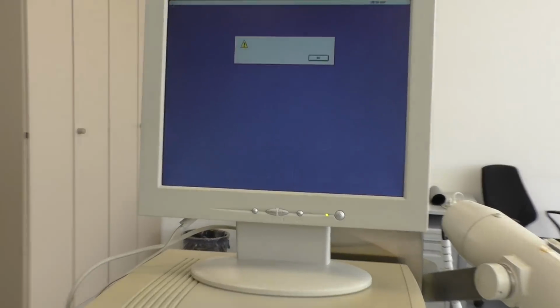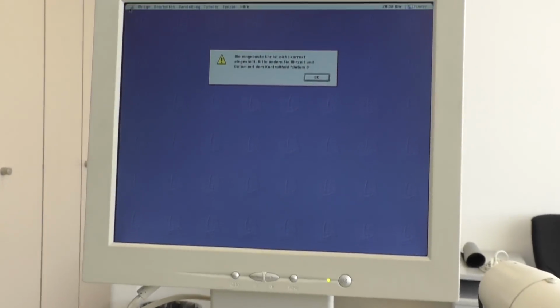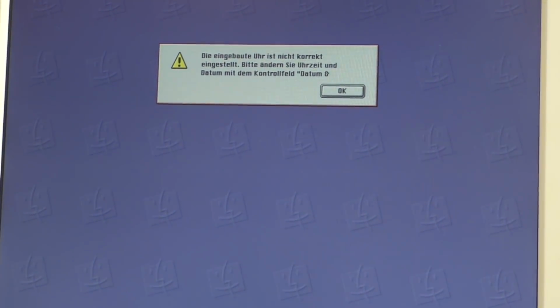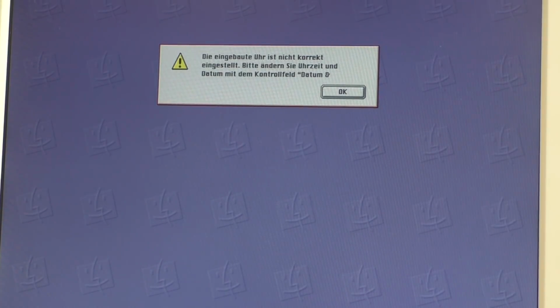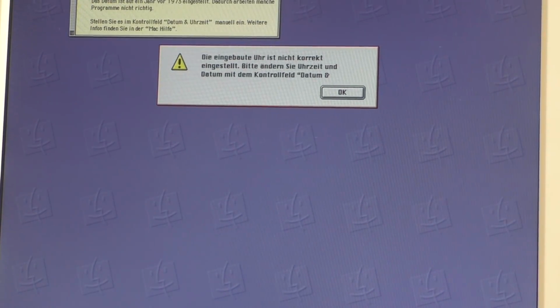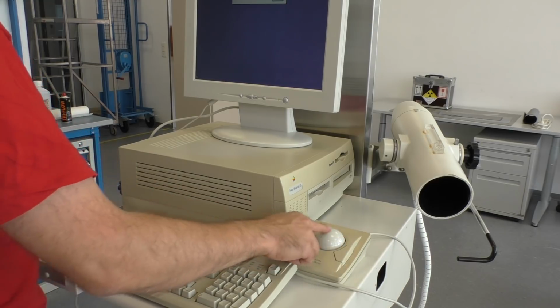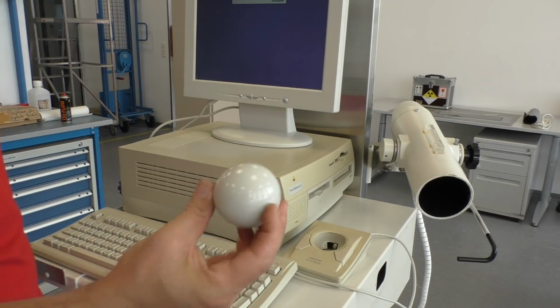Okay, there's a message. Yeah, it complains that the clock is not set. Possibly the battery is empty. Well, let's try to set the date. So that's the mouse here. It's a trackball. You can see that.